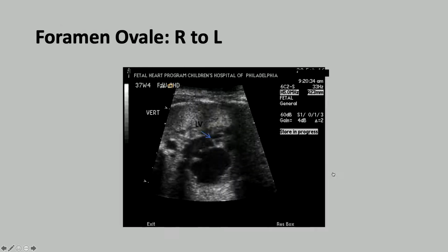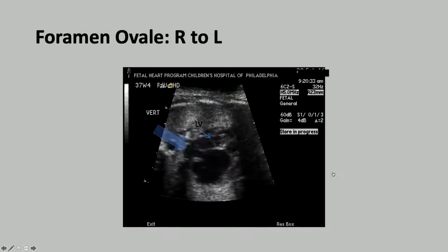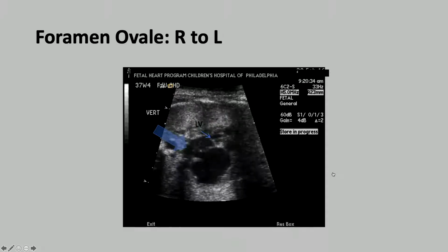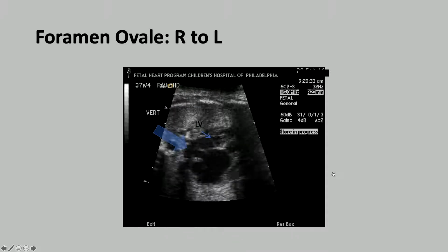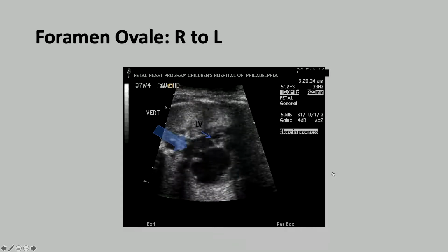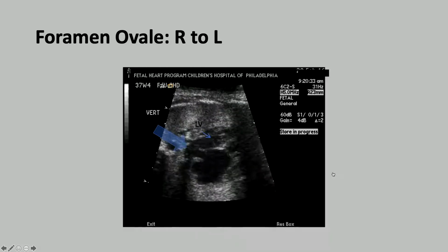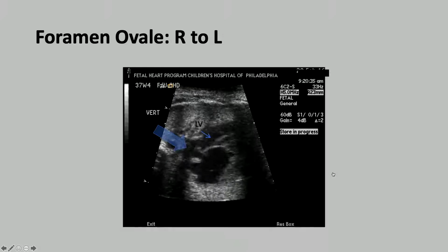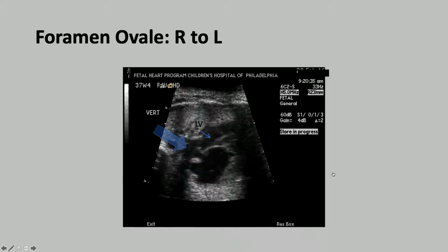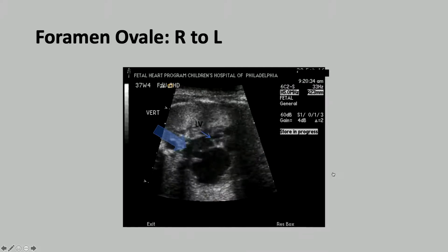But take a look at this here. The arrow is going to point to it there in a moment. Look at the atrial septum. It's bowing right to left, which is the way the atrial septum should normally be bowing. Well, as we just said a moment ago, if this is a small left ventricle and inadequate and HLHS, how could the atrial septum be bowing right to left? Left-sided pressure should be high. This flow should be left to right, decompressing.